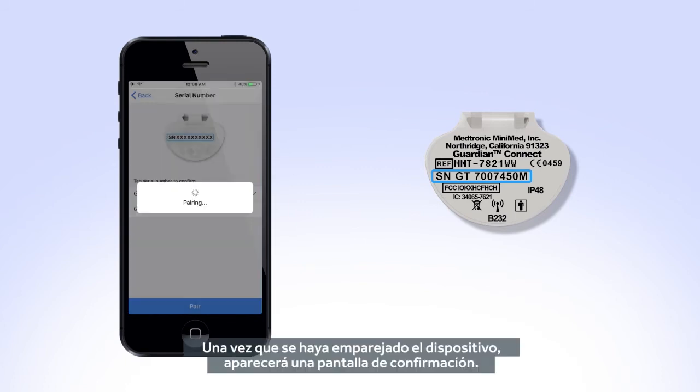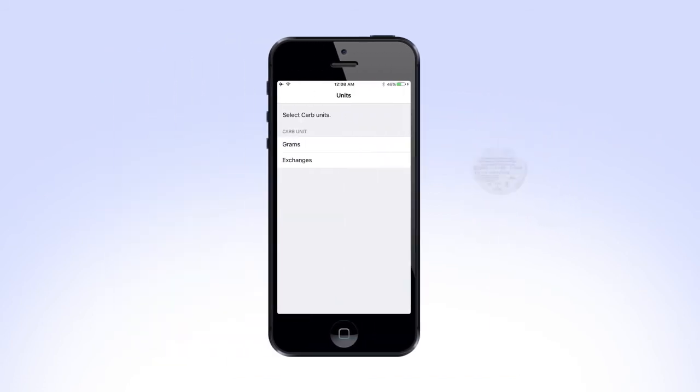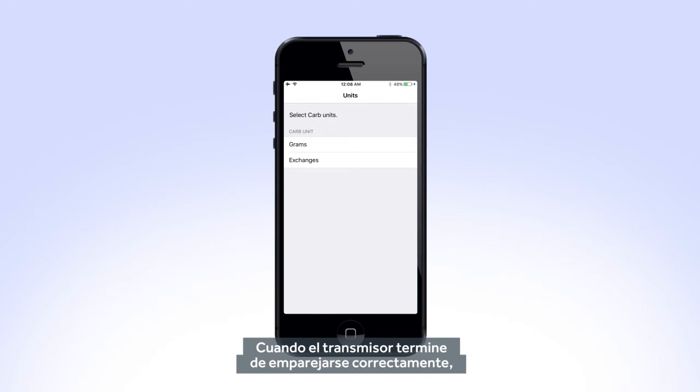You will see a confirmation screen once the device has been paired. Select OK to continue. After your transmitter finishes successfully pairing, your app will ask you to select which CARB unit to display. Select your desired unit and press Next.